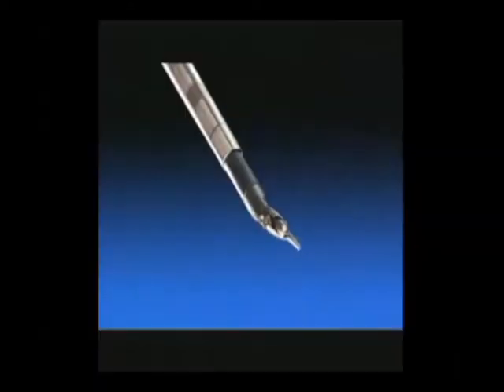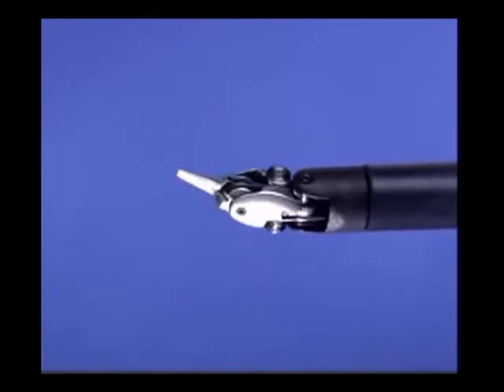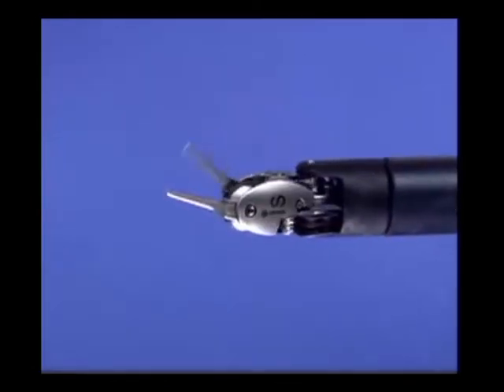Now the robotic arm, as you will see, is very slim, and instead of the whole arm being there, it's just a little pencil type of thing which goes in, and then the surgeon can manipulate it. The other advantage that I find is that a human arm you cannot rotate even 180 degrees, but with a robotic arm, you can go 360 degrees. Goes right round. And that has an advantage in suturing, in getting precisely at the tissue that you want to get, and in working in the depth. The magnification is about 10 times, which means that even an RBC appears to be such a big size that bleeding is not an issue, which is the problem with laparoscopic and open prostatectomies. The ordinary, or conventional, kind of surgery.